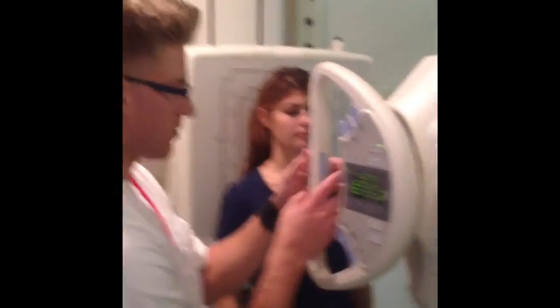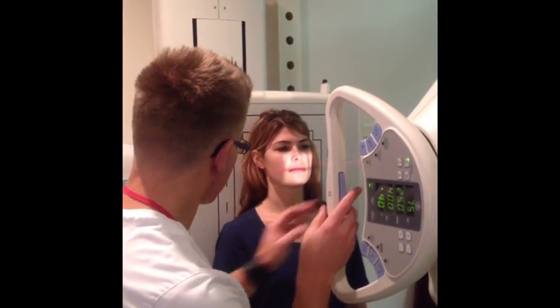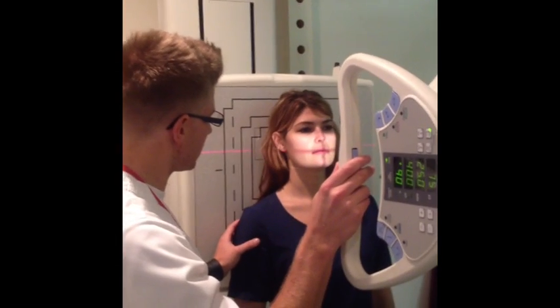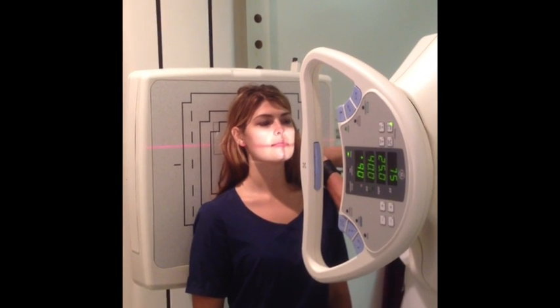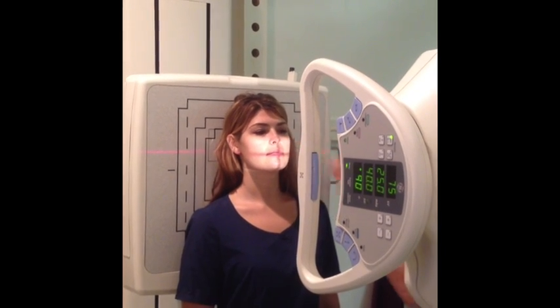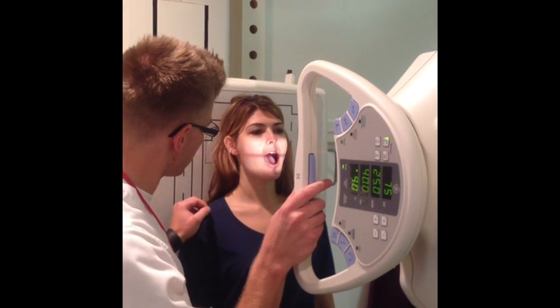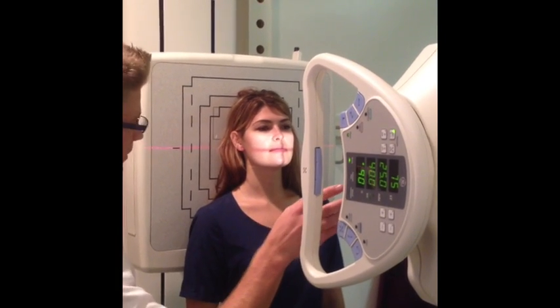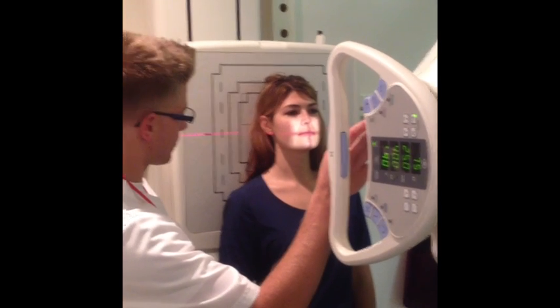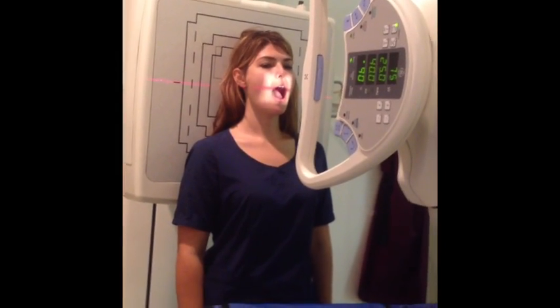Go ahead and put your back against the board. Close your eyes for me. Take a small step to the left. Put your chin up slightly — right about there. Make sure my marker's in the right spot. Open your mouth for me — open your mouth real nice and wide, as wide as you can. Hold still. And x-ray.